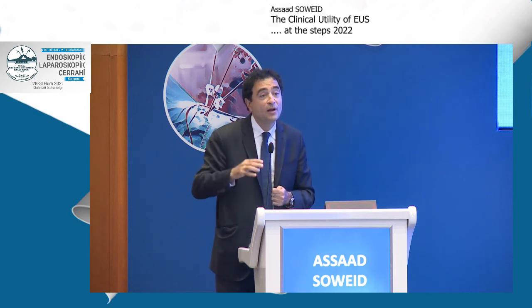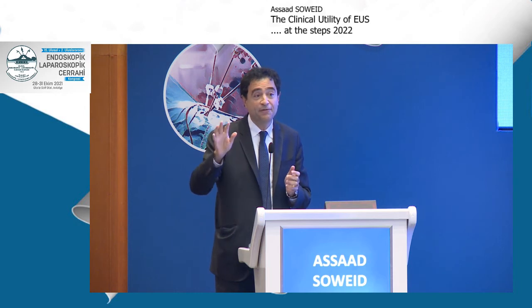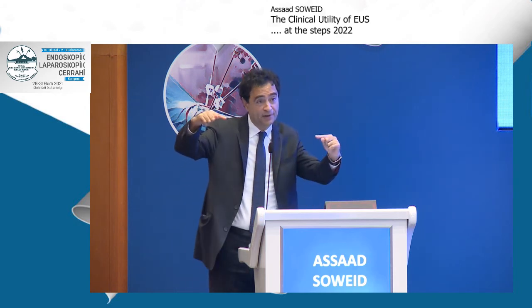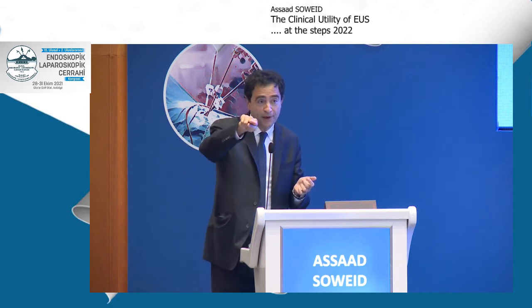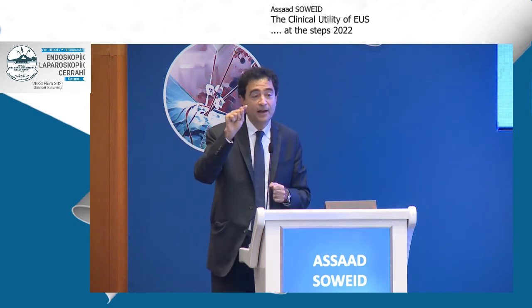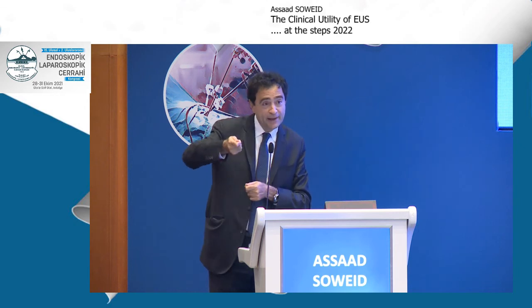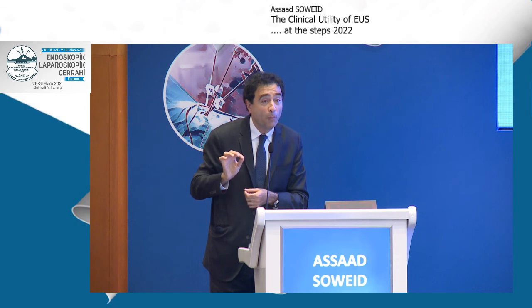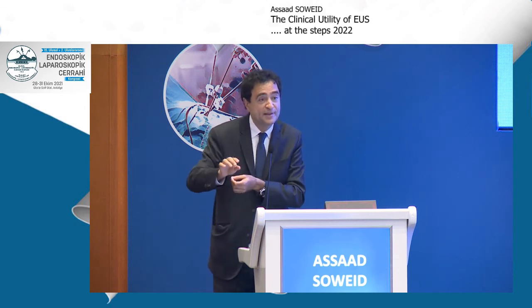We have to keep 2 double pigtail plastic stents, and the size in the past was 10 French. Now 7 French is enough. There is some data on putting them in different parts, not in the same hole, but I think both are fine, whether you do them in the same opening or in 2 different openings in the stomach. It can be done by a needle knife, by a sphincterotomy, by putting a needle through EUS and then a guide wire, or by a cystotomy. So many techniques, but the concept is the same: open, dilate, and put a stent.